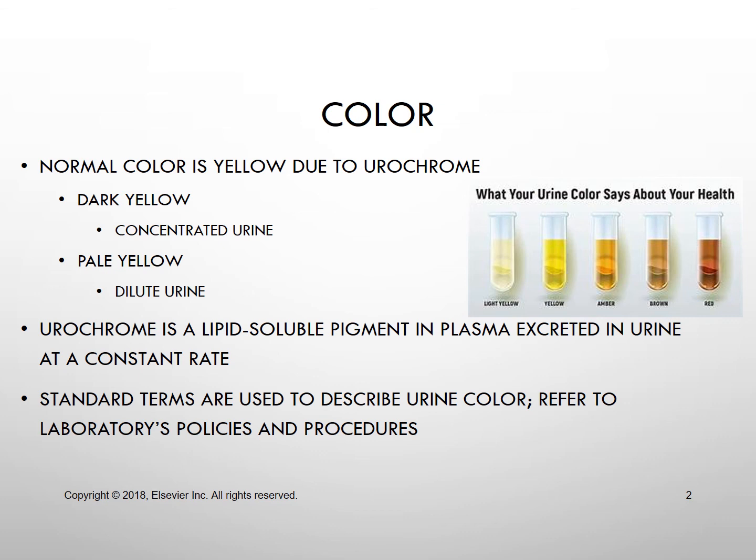So urine color, which is normally various shades of yellow, can range from colorless to amber, orange, even green, blue, brown, or black. These color variations indicate the presence of a disease process or some kind of metabolic abnormality, or some certain type of ingested food or drug. These color variations can result from excessive physical activity or stress as well.